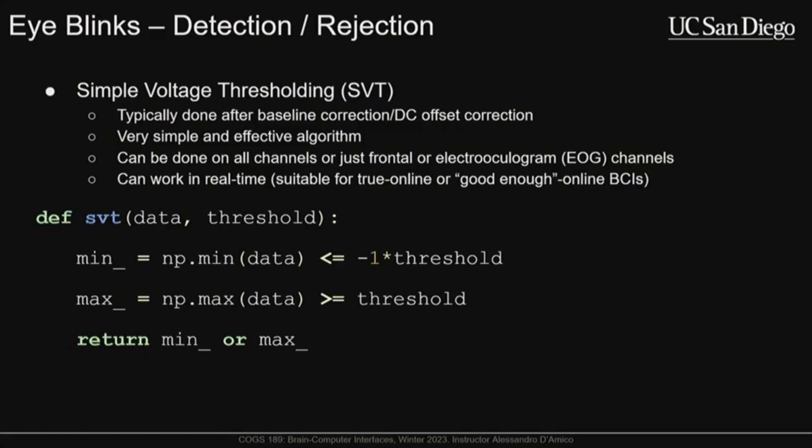You could also use smaller windows, so you don't necessarily need to use the entirety of the epoch. You could say, okay, if a blink exists at this time, it's super critical, but if it exists maybe towards the end, it doesn't really matter, and we'll just explain that in our epoch, or we'll shorten the window that we're plotting to show people that the blinks don't matter.